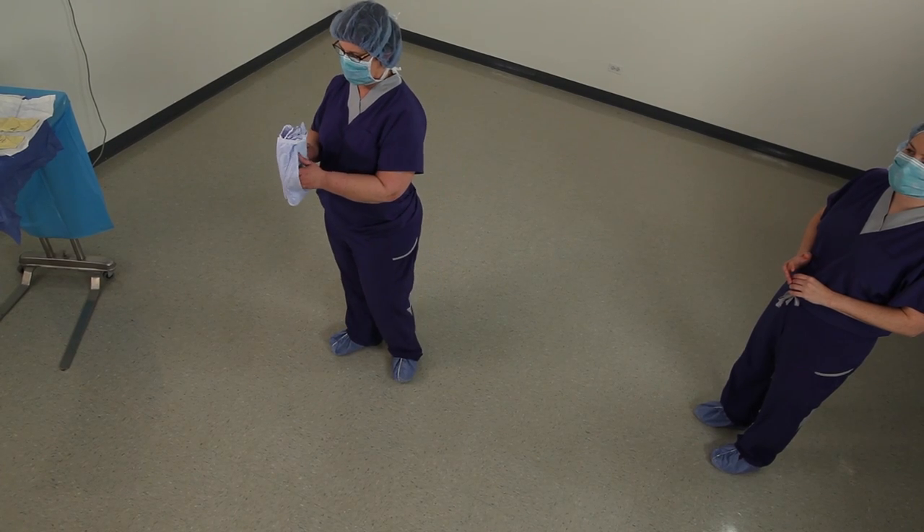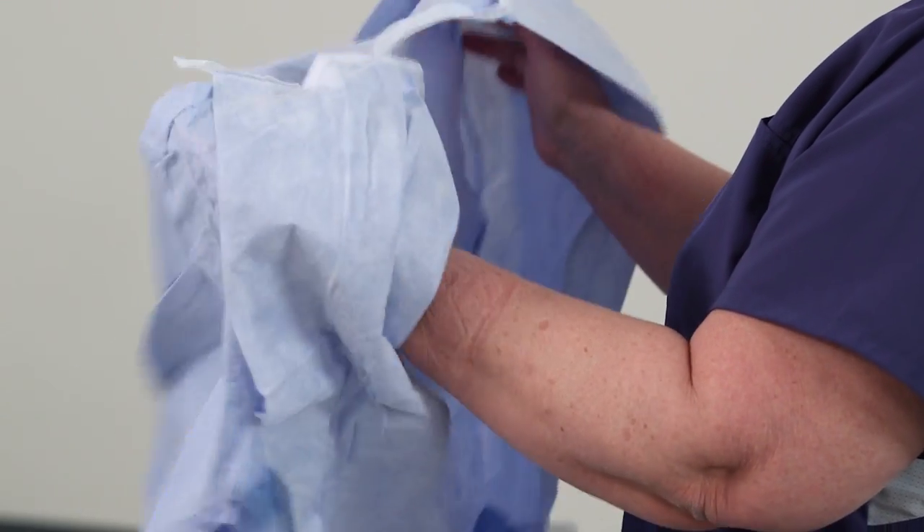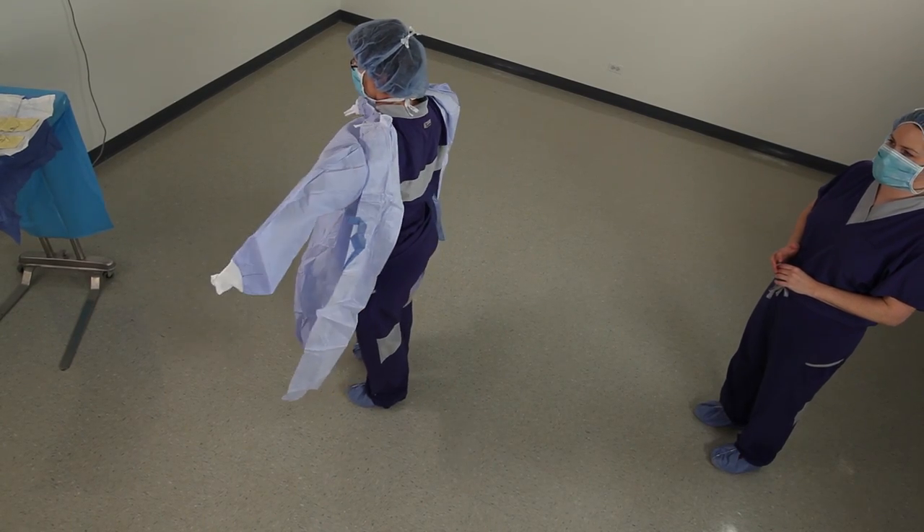Place right and left hands under respective flaps with the side-stamp facing chest. Slowly open arms and allow the gown to unfold toward the floor.